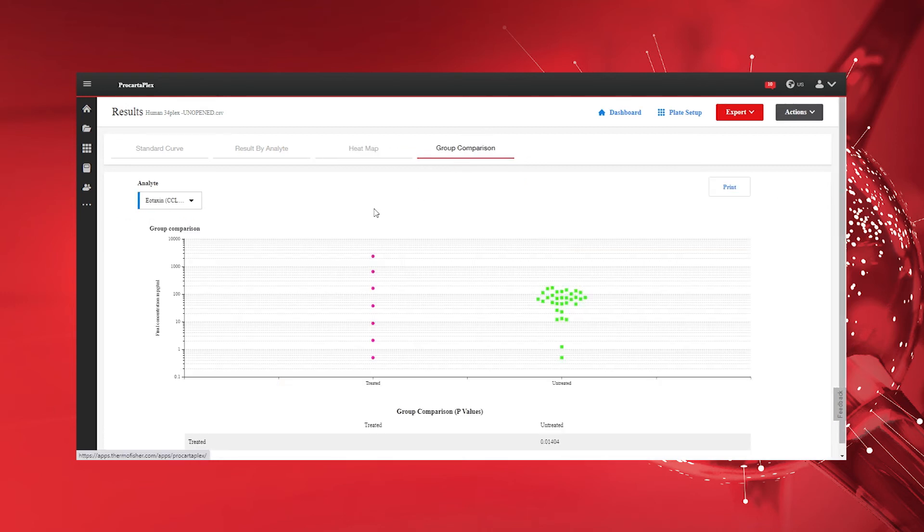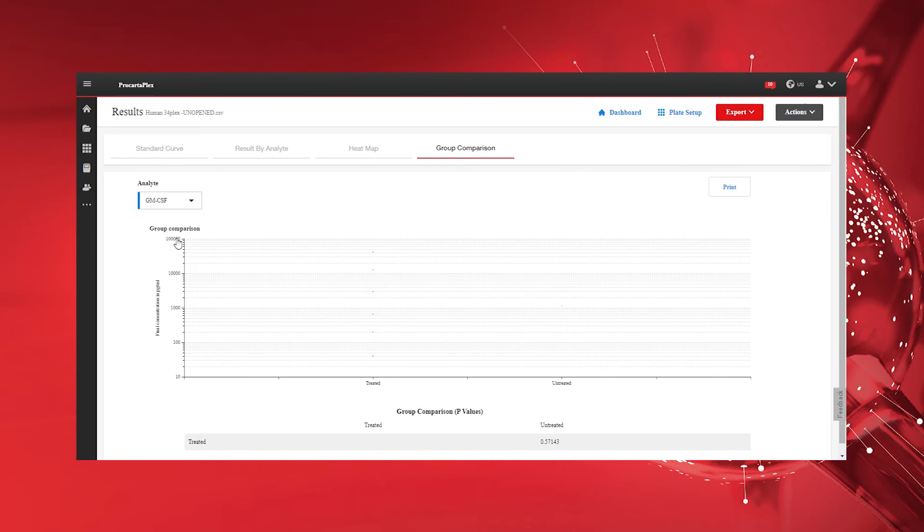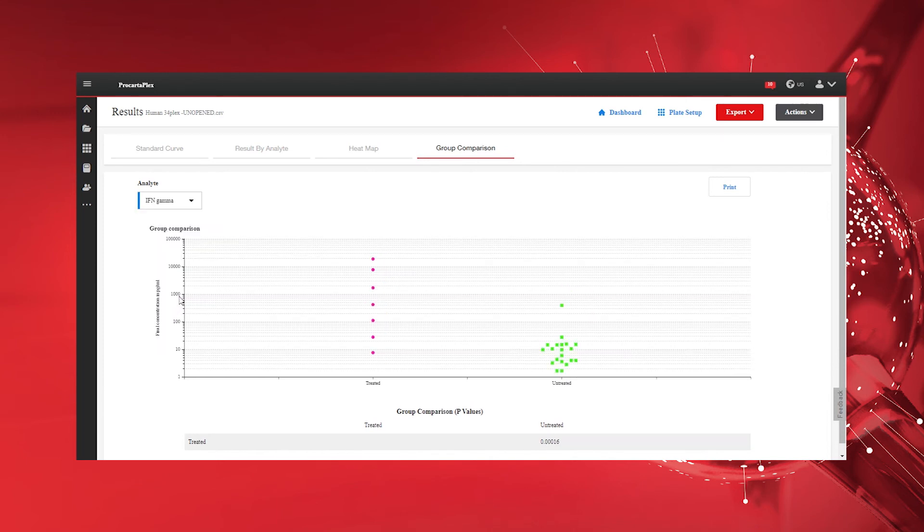The Group Comparison tab provides a view of grouped samples in a plot and calculated p-values to compare statistical differences. Easily print the Group Comparison plot by clicking the Print button.